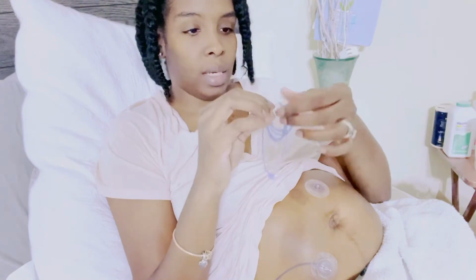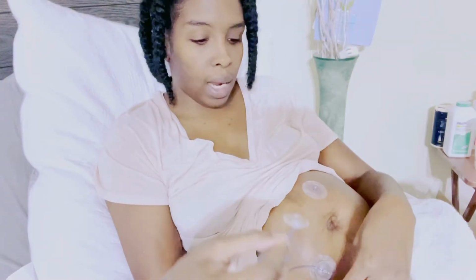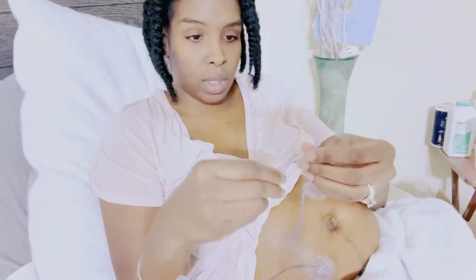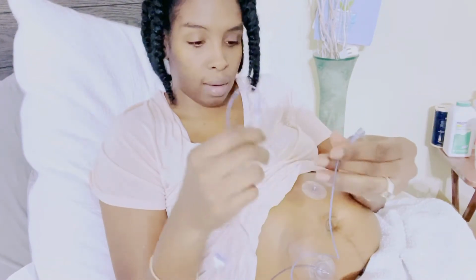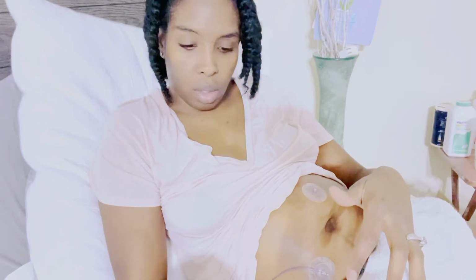So now we're gonna open this here, and I like to make sure this is not anywhere near anything dirty and facing upward, so that it doesn't get contaminated. I do the same with this. What's happening now is this machine is paused, so no medication is running out of it. So I'm just going to put this upward. You should put it in your bin, in your little basket, so that this doesn't get contaminated. See how it's facing upward and it's in the dish or the plastic.